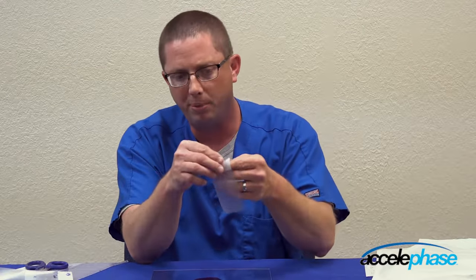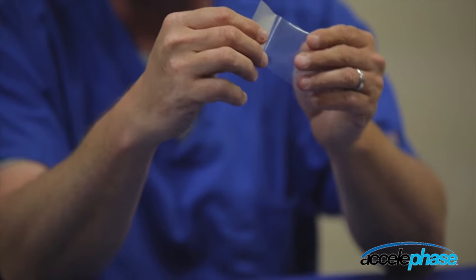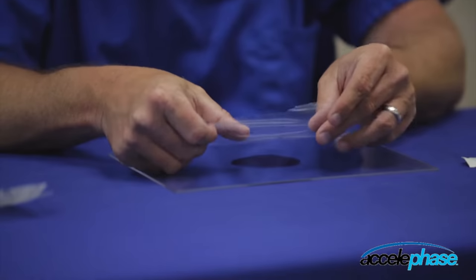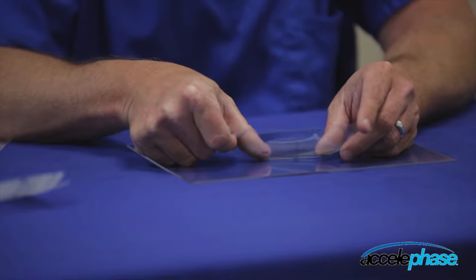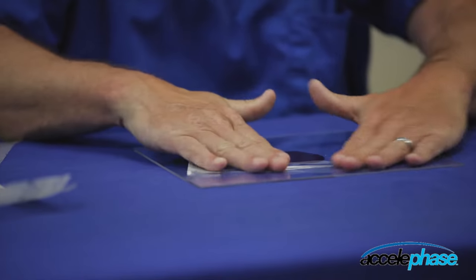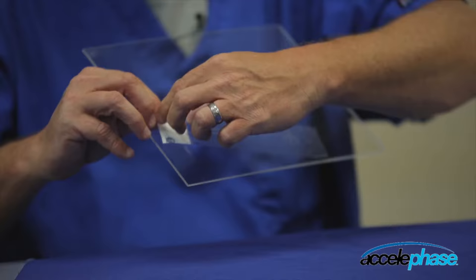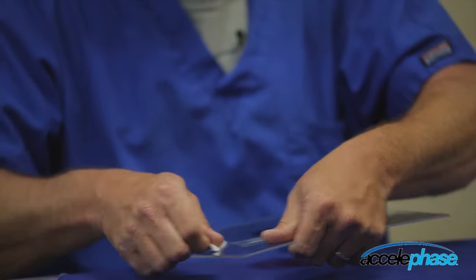The drape is removed by removing number one first off the back side, then you can go ahead and remove number two. You want to windowpane around the wound margins. This ensures if your foam is slightly too big, it does not come in contact with good skin. So you take the drape, walk it around there, flatten it out, then remove number three. Then pull the tab, and continue this process until the entire peri-wound is protected by drape.